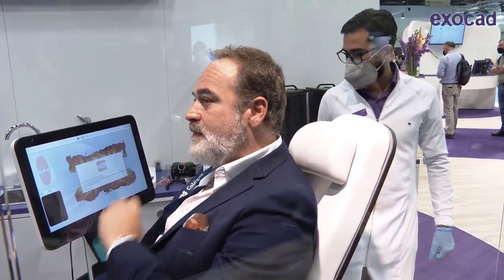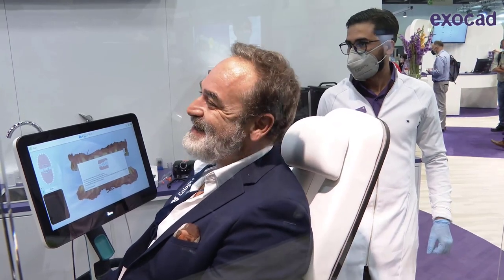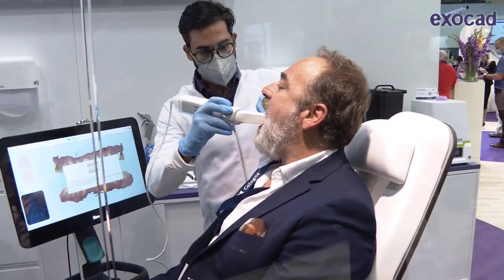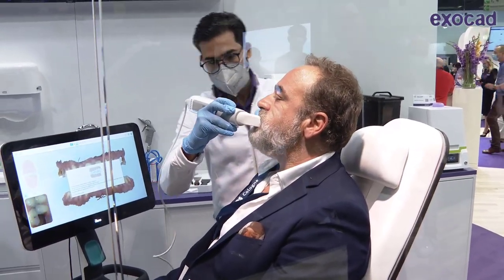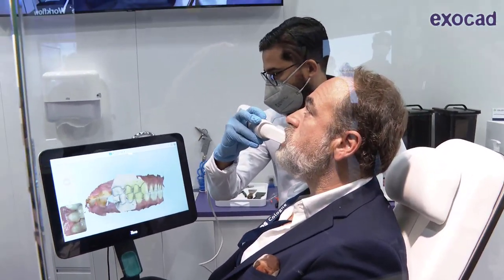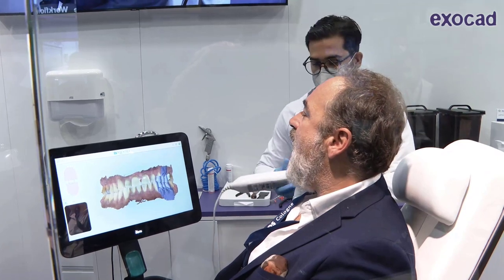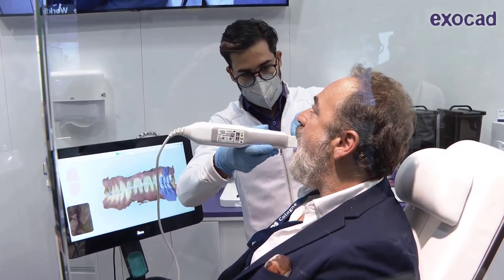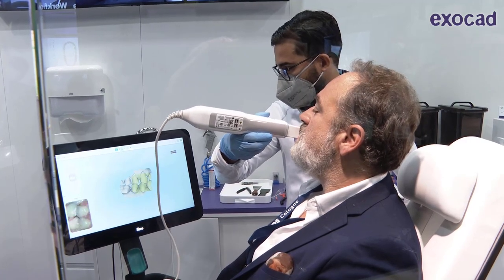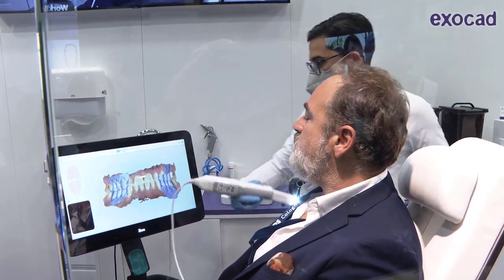The bite scan is quick. Once in position, we place our lens at the height of teeth 5 and 6 to 5 and 6 in the FDI system — the second premolar and first molar — and we move the lens up and down. We take one side, then always take the second side if possible. Start the scan, go a little up and down towards the gingival, and stop. That's the full scan.